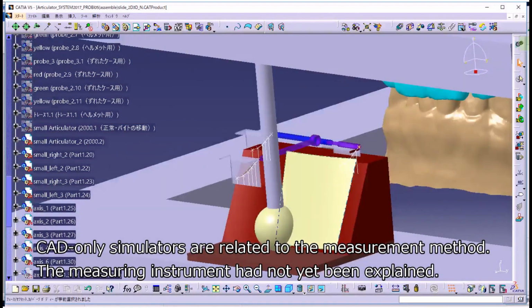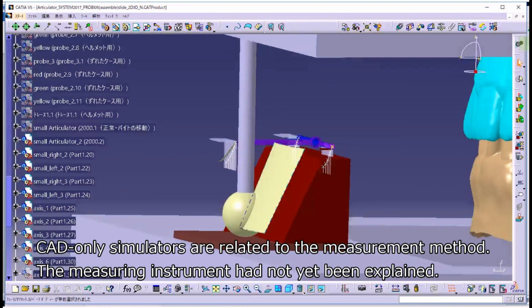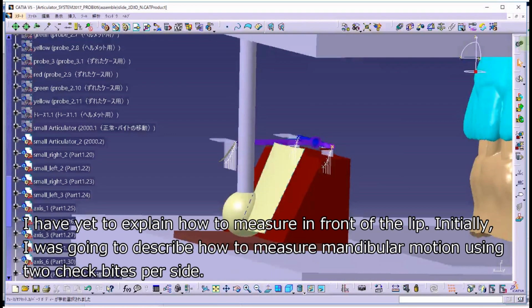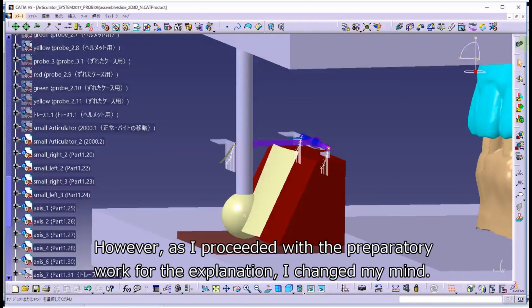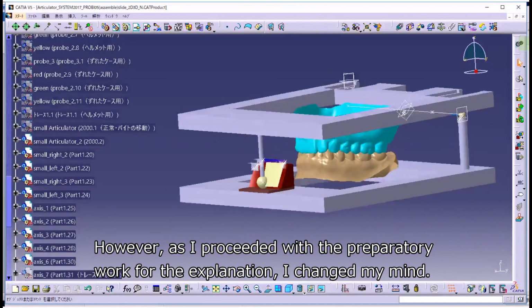CAD-only simulators are related to the measurement method. The measuring instrument had not yet been explained. I have yet to explain how to measure in front of the lip. Initially, I was going to describe how to measure mandibular motion using 2 check bites per side. However, as I proceeded with the preparatory work for the explanation, I changed my mind.